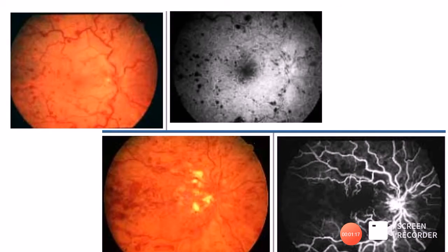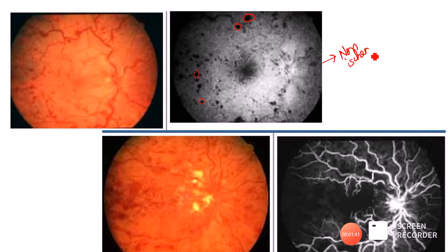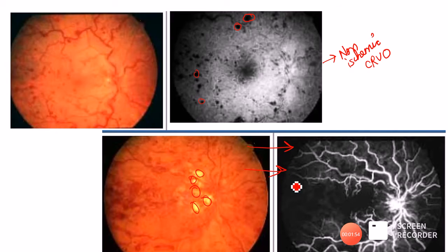This picture shows two patients with CRVO. In the first patient, we see dot-blot hemorrhages causing blocked fluorescence, but no capillary non-perfusion areas — indicating non-ischemic CRVO. The second patient has many cotton wool spots suggesting ischemic CRVO, and on FFA we see extensive capillary non-perfusion areas with almost the entire fundus appearing black, confirming ischemic CRVO.